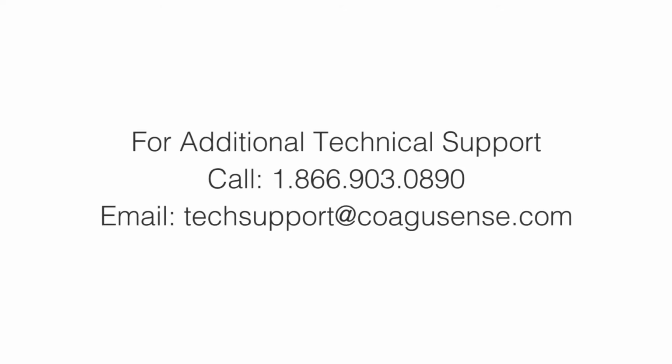If you encounter any error or require technical support, please call Coag-Sense Technical Support at 866-903-0890 or email at techsupport@coagusense.com.